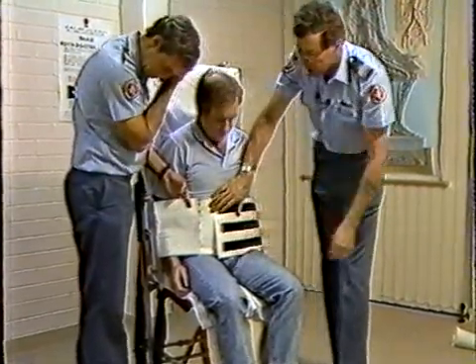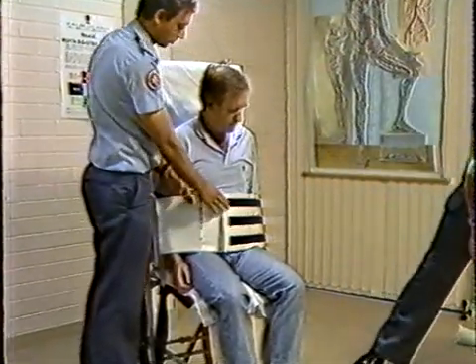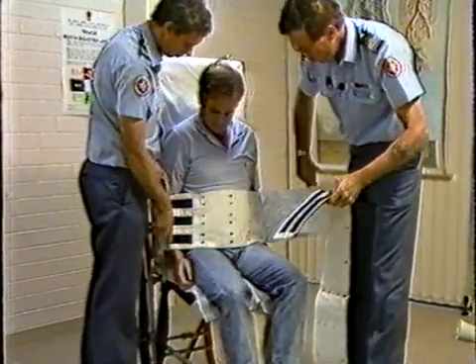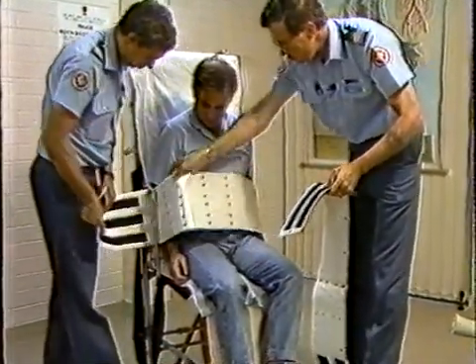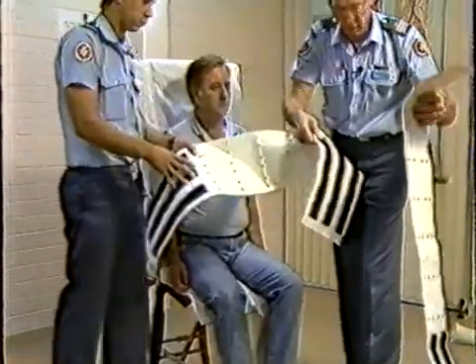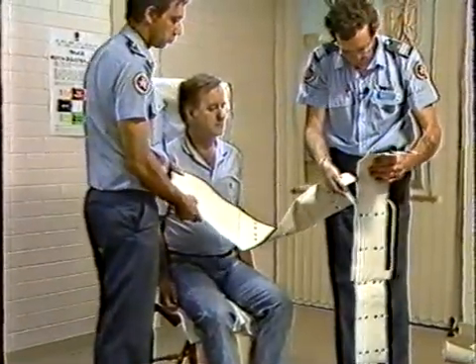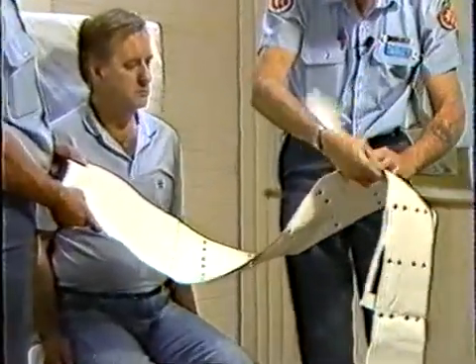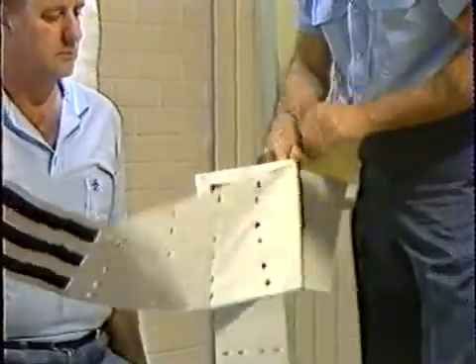So the way over that is, get the next smaller size and we'll add on. So we'll take this one back off, and what you're going to do is add on and bring it up, and 2 inches is sufficient for a good grip. So we'll go 2 inches up and around we go again.